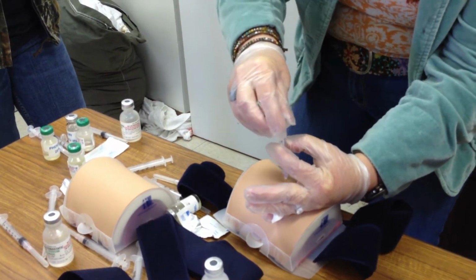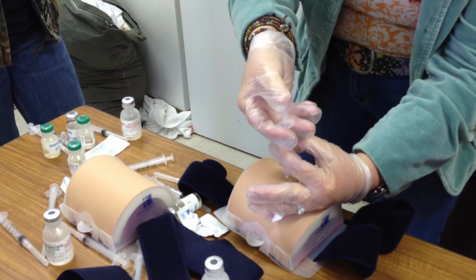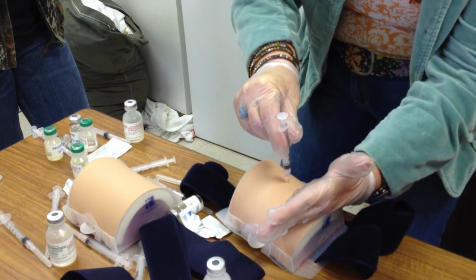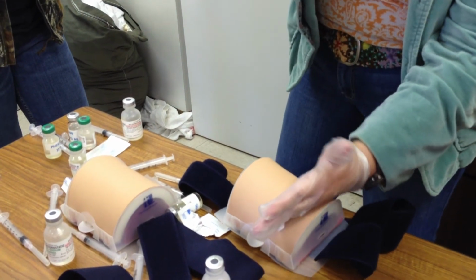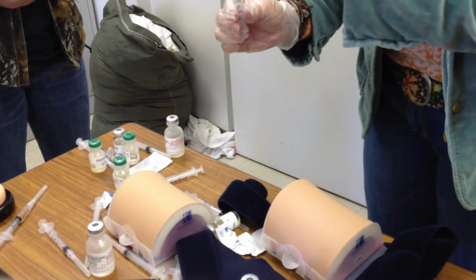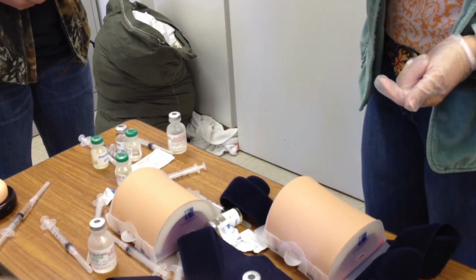I'm going to hold. I'm going to aspirate. Make sure I'm not in a vessel. Smooth and steady in. Let go. Hands out of the way. Smooth, straight up and out. And all you've got to do is hands off the patient. Let go. And then get your needle safe so that you can't hurt yourself or anybody. Whoa, balancing act. Okay. And then you're ready to go.